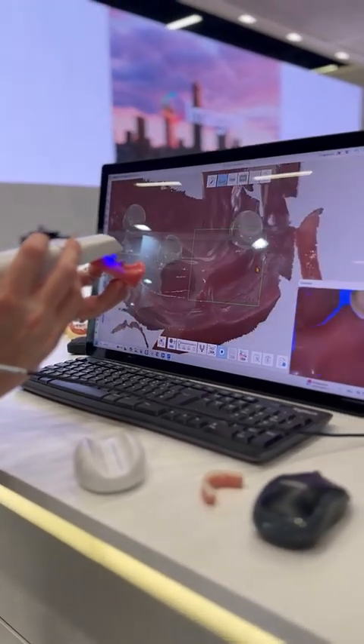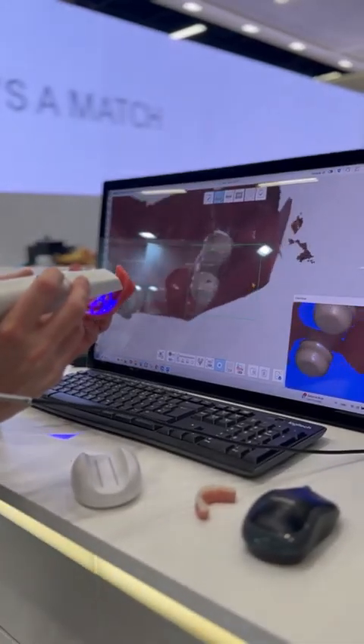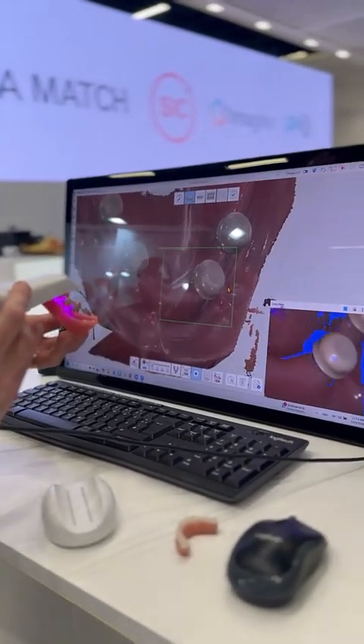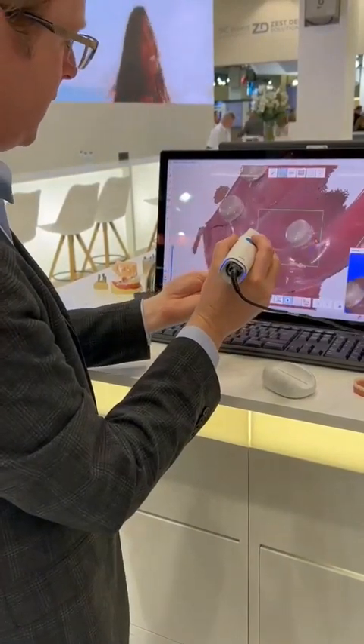Do the buccal, twisting a little bit, filtering out the finger that's there — no problem. Locking in that little undercut area underneath the abutments, making sure that's all scanned properly, joining together my locator abutments, clicking my button and I'm done.